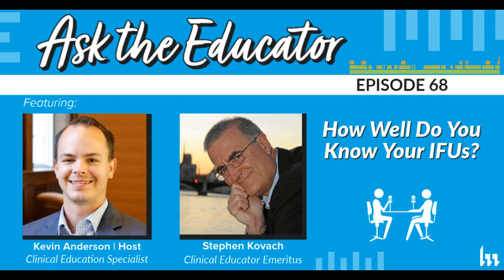Well, this is a very common issue. And I think the first thing to do is to just start using the IFU as your example and doing things according to the IFU, just so you're challenging your own assumptions. Sometimes people think, oh, yeah, it's going to cost me this much more in time and productivity. And that may be true, but it also may be true for only the first couple of days while people are getting used to a new practice. And then by the time they're really proficient at it, it really didn't add a whole lot of time at all, or not a tangible amount of time.